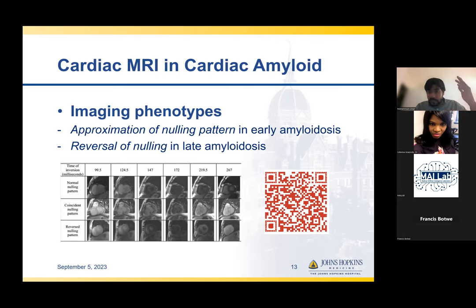the longitudinal recovery has progressed beyond the null point, so it starts appearing as gray, right? So this is what you see at these timelines. At the same time, the myocardium, which is holding on to less gadolinium than the blood pool, is still not nulled yet. You're still getting to its null point, which is somewhere about 250 milliseconds in normal people.